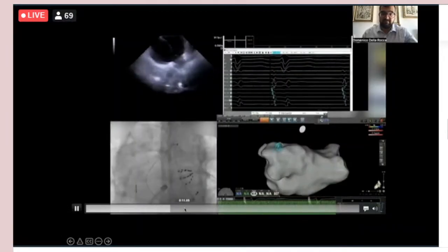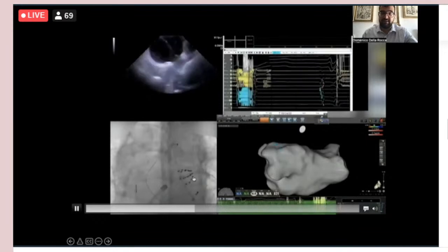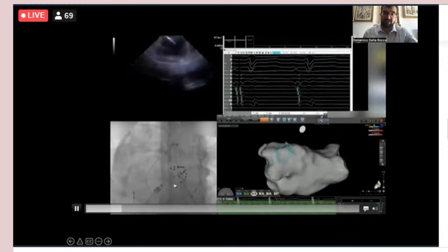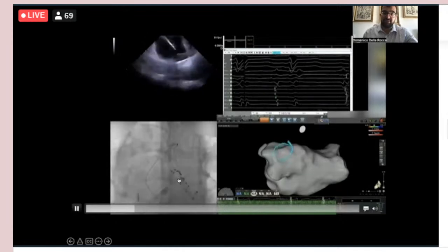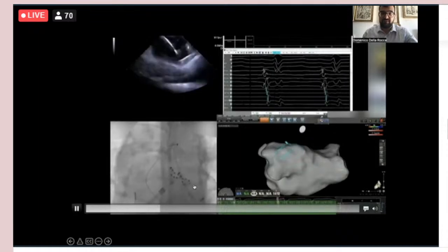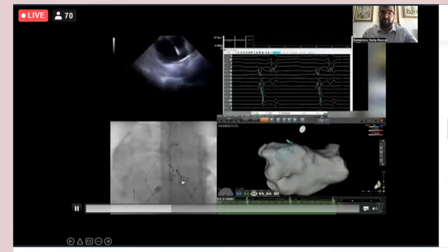We then wired the left inferior and did the same procedure, a first couple of trains in a basket configuration, then a rotation of approximately 30 to 40 degrees in a basket configuration, and then we came more proximal and deployed the ablation catheter in a flower configuration, as you can see here, advanced, and then deployed two pairs of trains at this antral position of the left inferior.